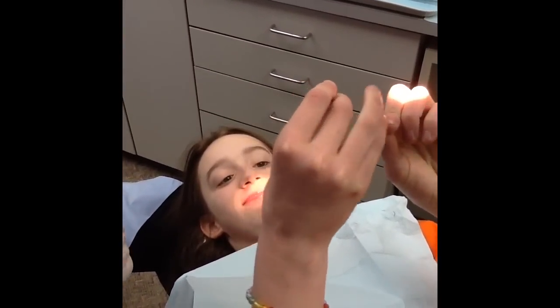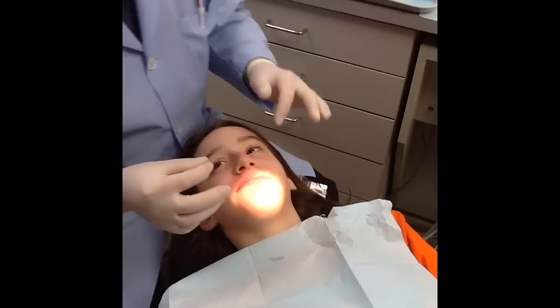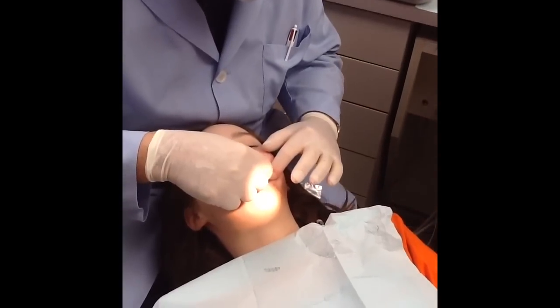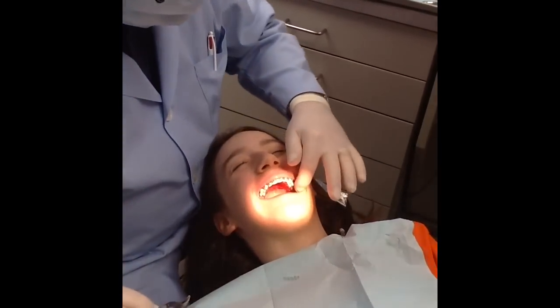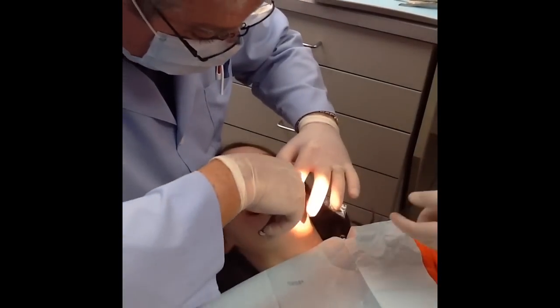I think we all need to do this one here. We're going to do this one here. The DRL itself is hot. It's hot.